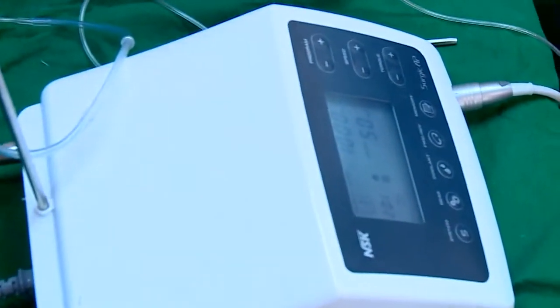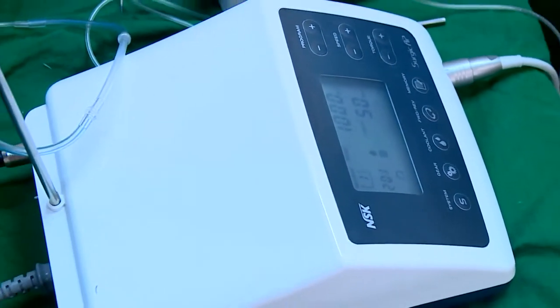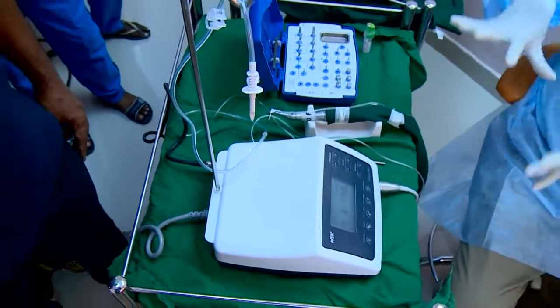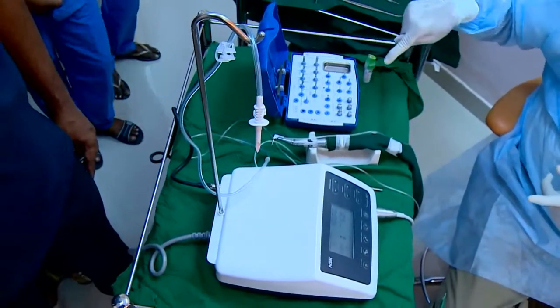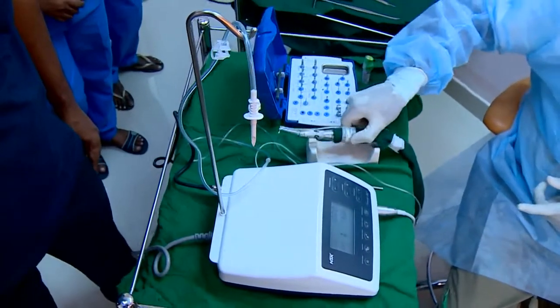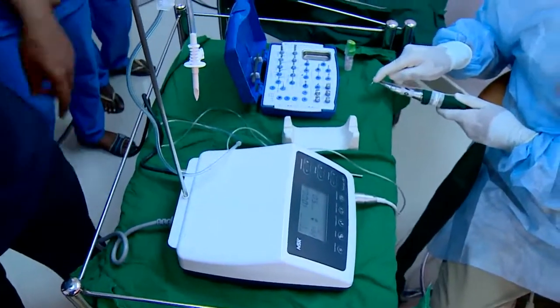The system we are going to use today is a MIS system. But at the end of the day, most of the implant systems are similar in the sense that whenever you are looking at a system, you look at the layout. It starts off with what we call a spade drill, which is what we have located in the focus point.